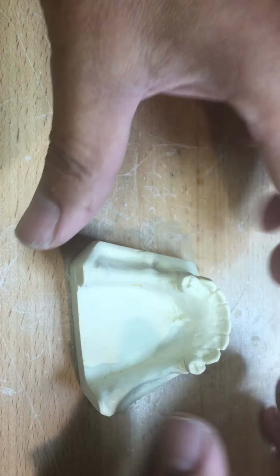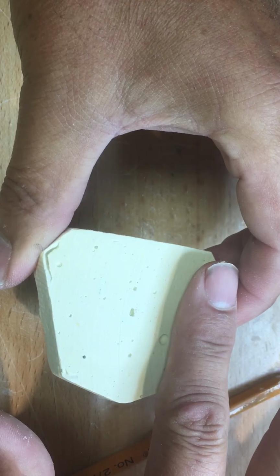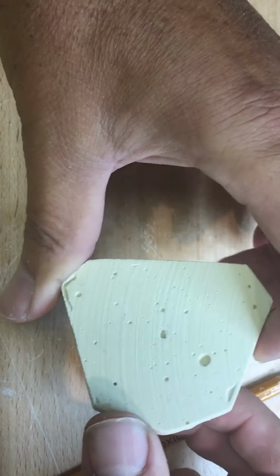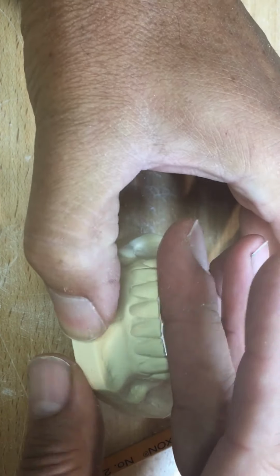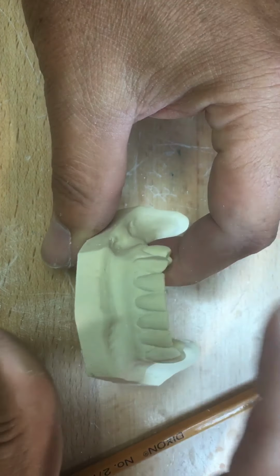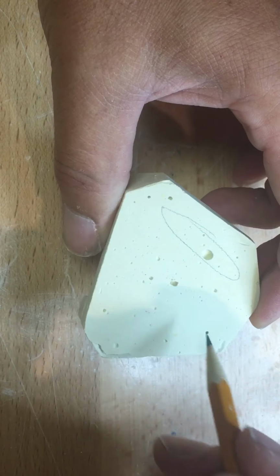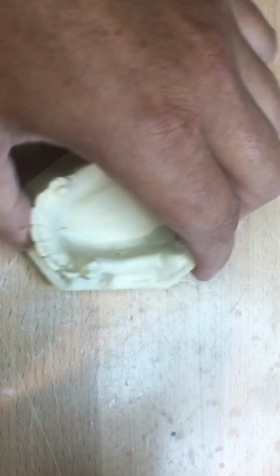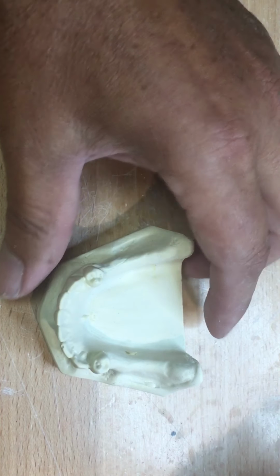So my first step is, even before picking up this pencil, it comes from the model department. Did the base of the model, was it trimmed flat or in one plane? This is for many reasons. One, to establish the occlusal plane, whether it's the edentulous section or the dentate, parallel to the base. This is going to help you in mounting. It's going to help you in setup. Also, a flat base, if it's keyed, will help you in processing. We don't want an odd base. It's going to help you in dismounting off your articulator. So the model sets up for many different things.